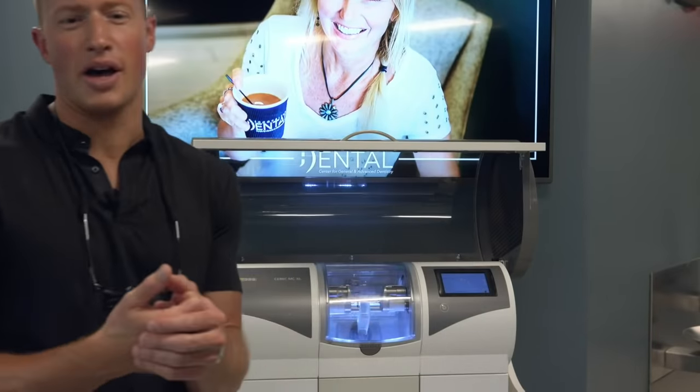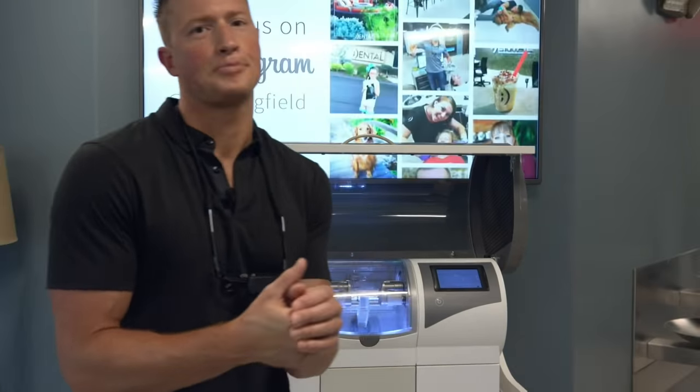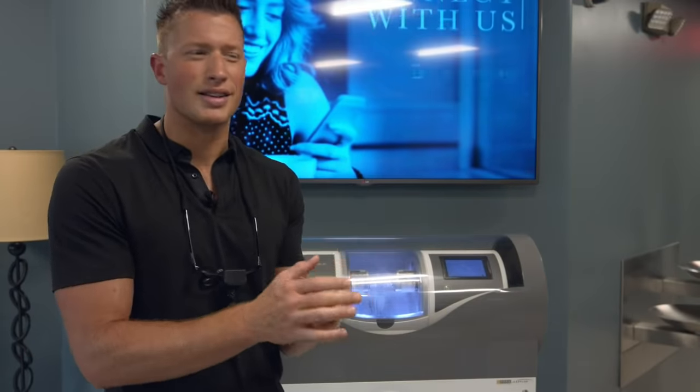This might be a good time. I'll talk a little bit about why guided implants, why I think they're so important, the benefits to patients, and what makes them drastically different than a free-handed implant. Most implants in our country still are placed free-hand, which just means that the surgeon is going to make an incision, reflect back tissue to visualize where they're placing the implant. It's because they don't have three-dimensional imaging and a guide that's helping place that implant without that need for visualization.